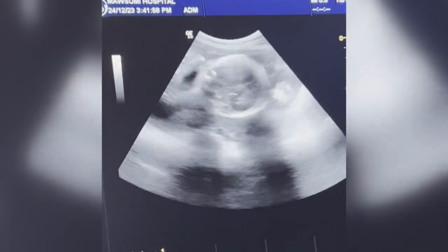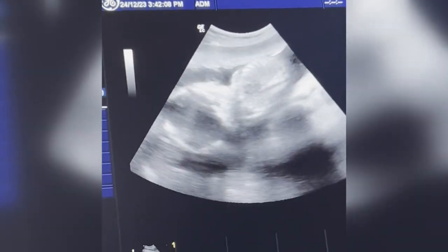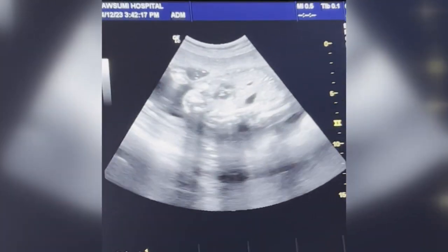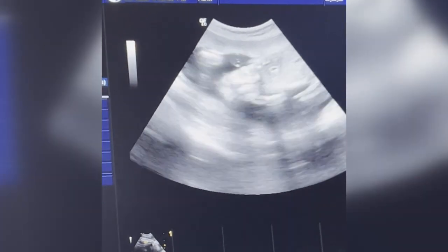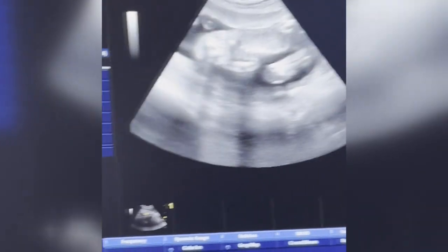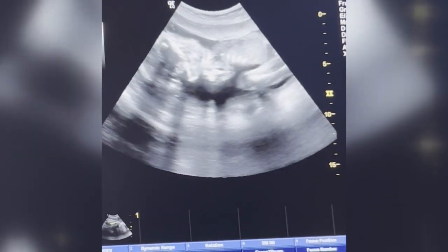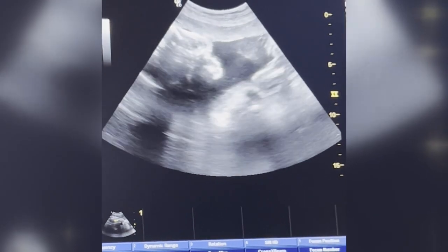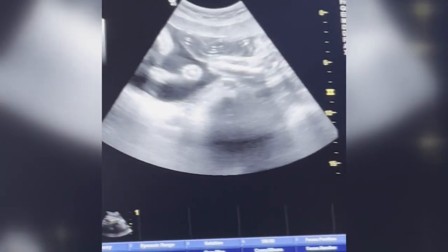We should go through spines. It is the lower part. So, it is the femur. You have to keep patience. Very patiently, and you have to move the probe very slightly. Little inclination, little rotation will give you better picture. The baby is moving very fast. It is moving its leg very fast, so I am getting a little difficulty.